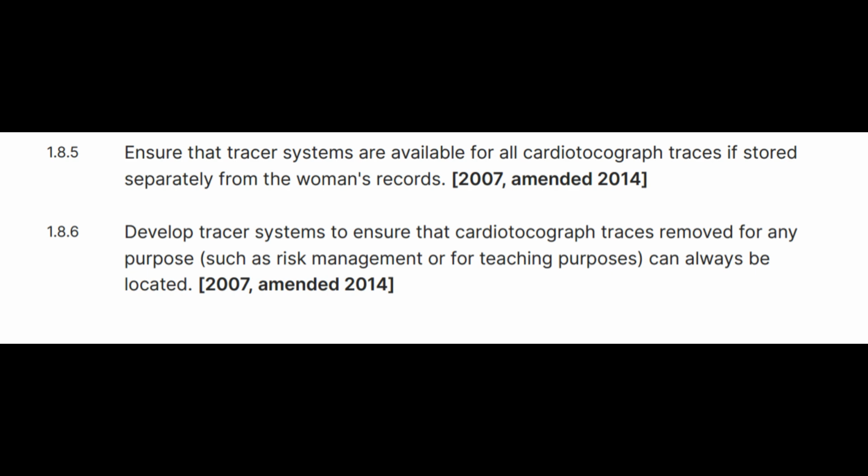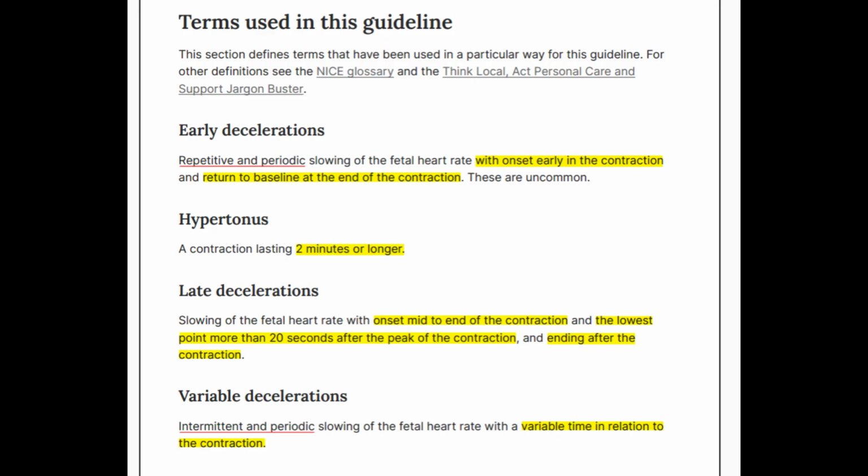Ensure that tracer systems are available for all cardiotocograph traces if stored separately from the woman's records. Develop tracer systems to ensure that cardiotocograph traces removed for any purpose, such as risk management or for teaching purposes, can always be located. Terms used in this guideline: early decelerations.